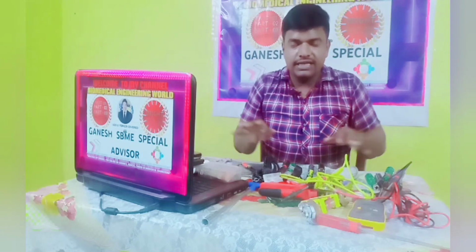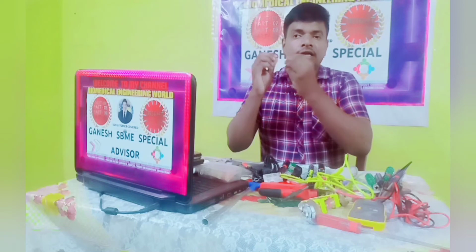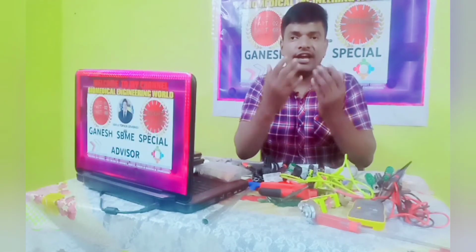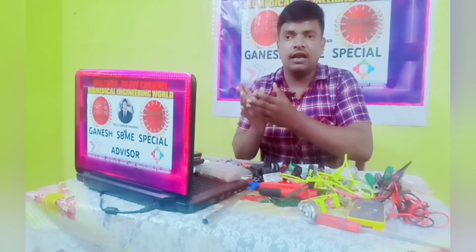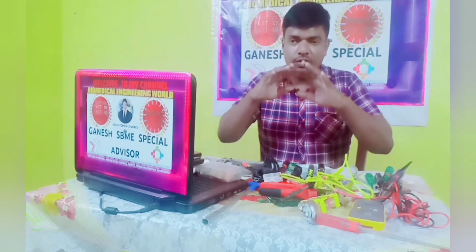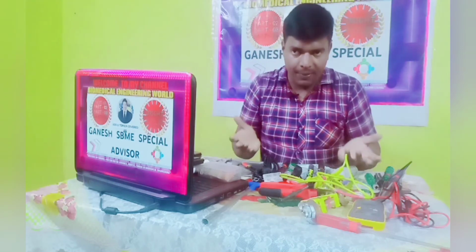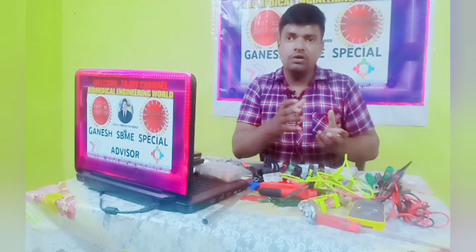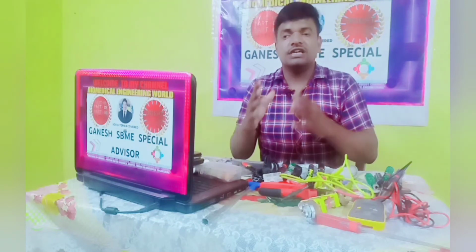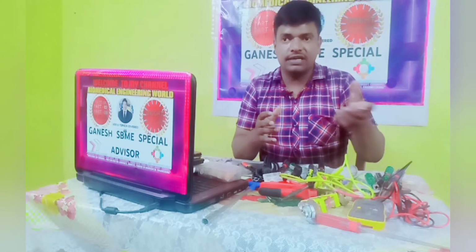So these are all toolkits a biomedical engineer uses to service, open and close the equipment, because without opening the equipment we cannot find the internal problems of the electronic devices. Sometimes we need not open it, because sometimes the power supply has an issue or an operating issue, or we fix accessory issues, or sometimes the machine does not switch on.